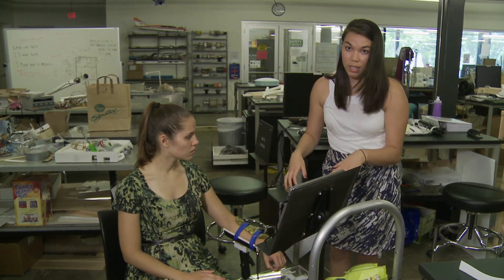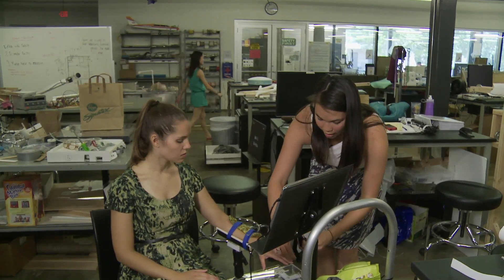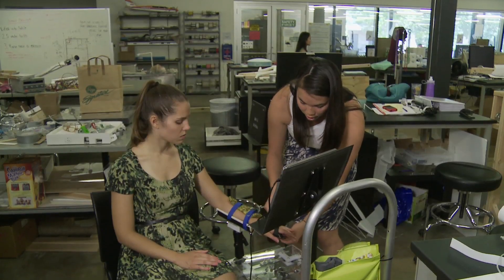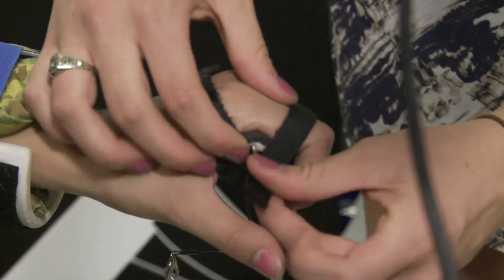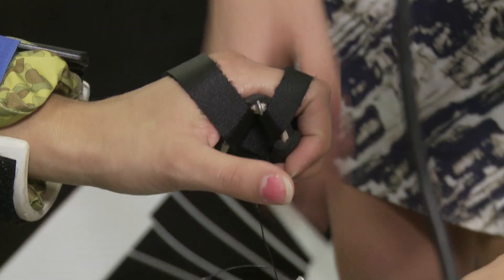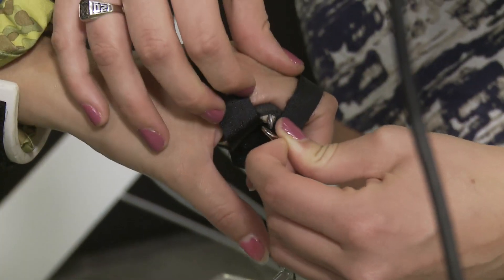The second component is the hand restraint. It goes underneath their knuckles and isolates their wrist muscles, so we're not getting any finger movements or things like that. Together, the two components ensure we're only measuring the wrist extensor muscles.